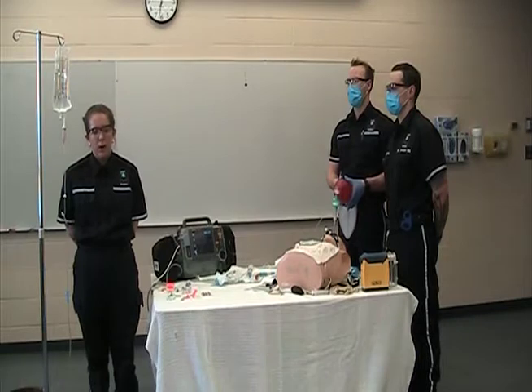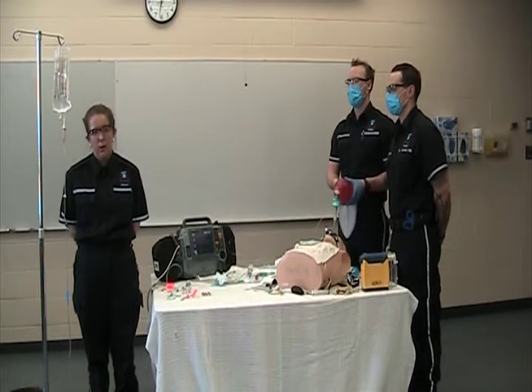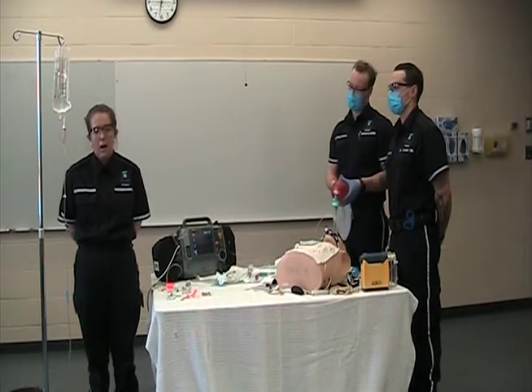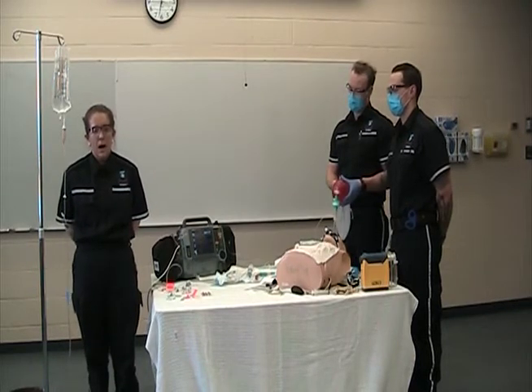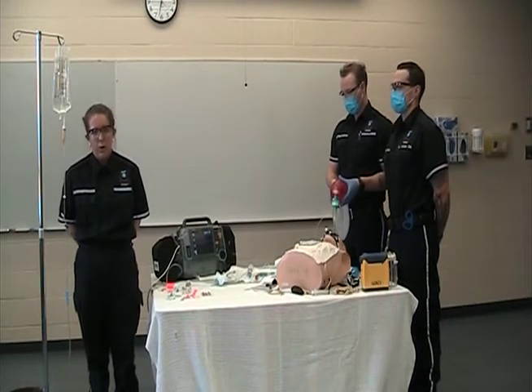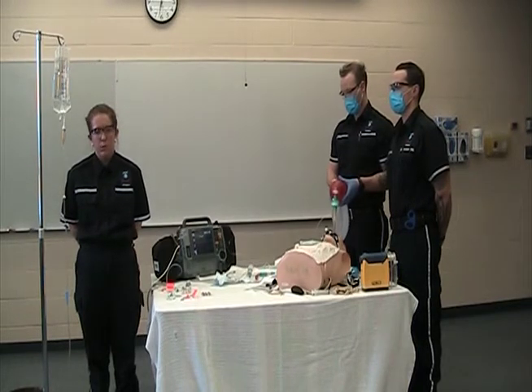P is pneumothorax. As with any positive pressure ventilation, you run the risk of causing a pneumothorax and potentially leading to a tension pneumo. At that point, we can do a needle decompression. The last thing we're looking for is equipment, so we'll make sure everything's plugged in and used appropriately. If at any point we run through our DOPE mnemonic and we cannot correct the difficult bagging, we will extubate and attempt to place a rescue airway.